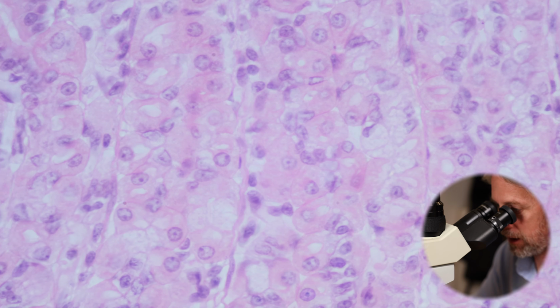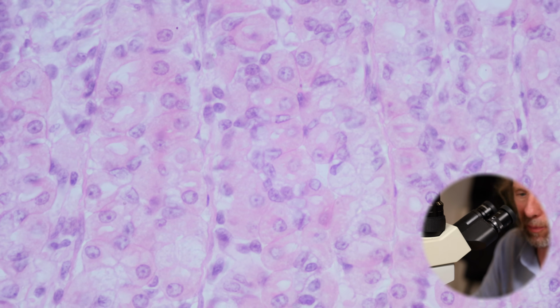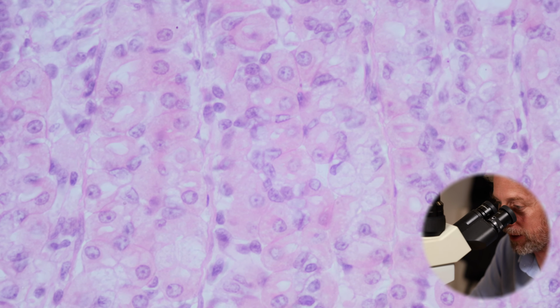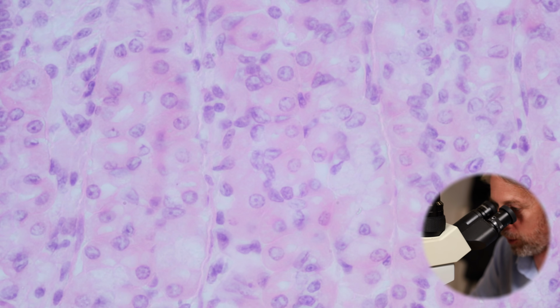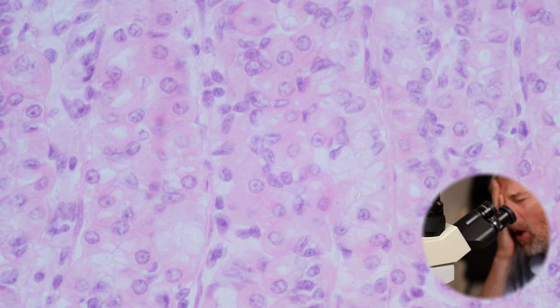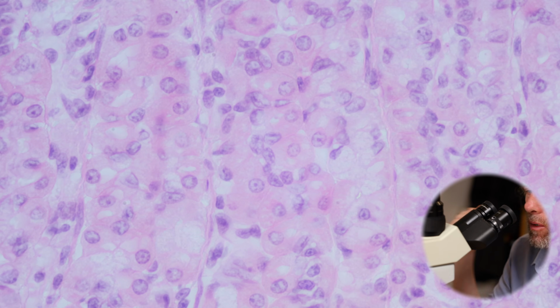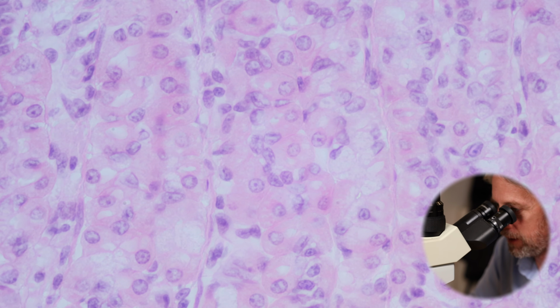So if we're trying to differentiate the two different cell types here, we can see lots that are pink and lots that are not pink, right? So the ones that are properly pink, those are the ones making hydrochloric acid. Those are the parietal cells. Parietal means wall. I mean, it's the wall of the stomach. Why are they called parietal cells, I wonder?